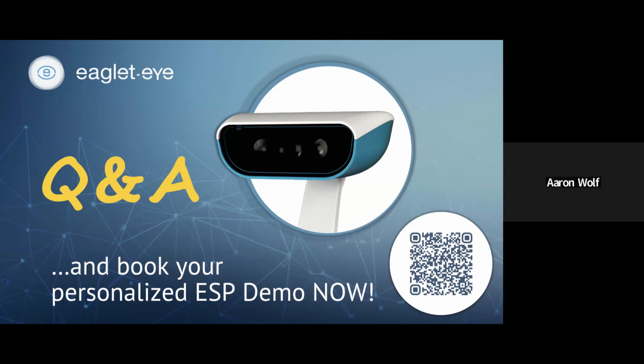What I found also is in particularly irregular eyes, like corneal grafts, maybe even more extreme keratoconus, you're going to really struggle on some other devices, whether it's a different type of projection device, or a scanning kind of tomography based device. They struggle a little bit more with particularly irregular eyes. It's almost like the software doesn't quite know what to do if there's too much of a jump in elevation, or the tear film just breaks up too much on that really high elevated spot.